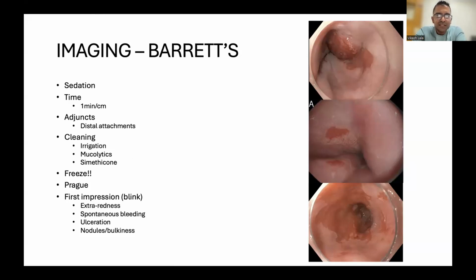Then the other thing I see a lot of endoscopists do is try to capture a moving image. It just doesn't work and it's just so difficult to do. Whether you're taking pictures or you're just assessing something, I urge you to use the freeze button on your scope. Know where your freeze button is, program it to an area that's convenient for you to access on your wheel, and freeze the image. It's very difficult to interpret a moving image, but when you freeze, you can spend time and actually sit back and just appreciate what you're looking at.